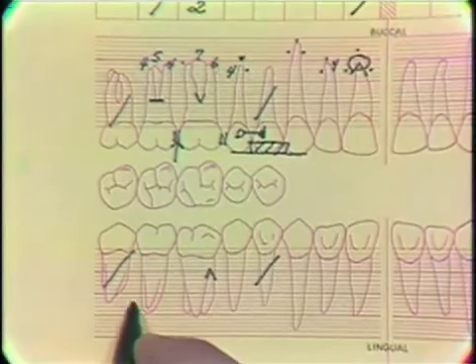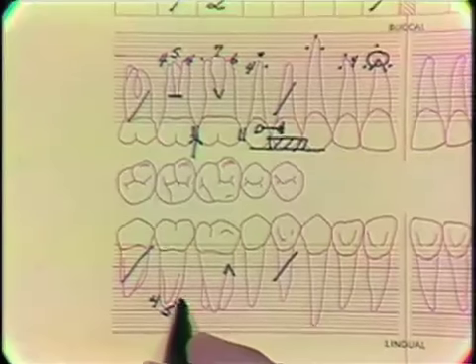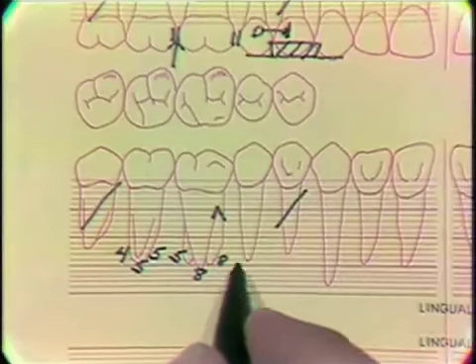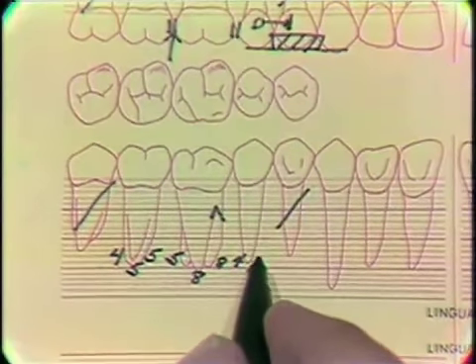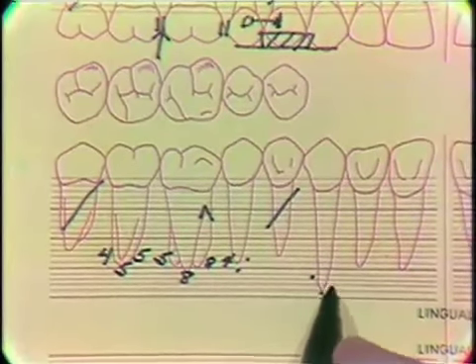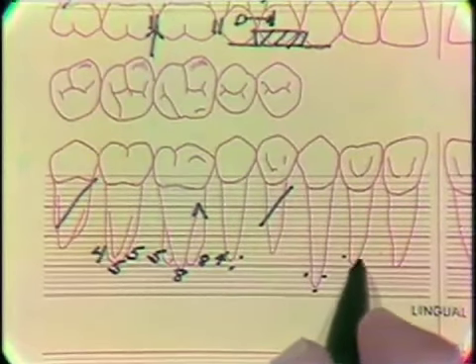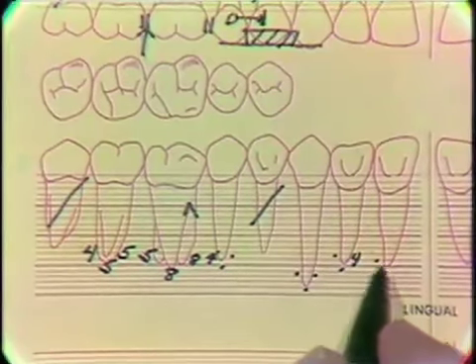4, 5, 5, 5, 8, 8, 4, 3, 3, 2, 2, 3, 3, 2, 4, 3, 2, 3.